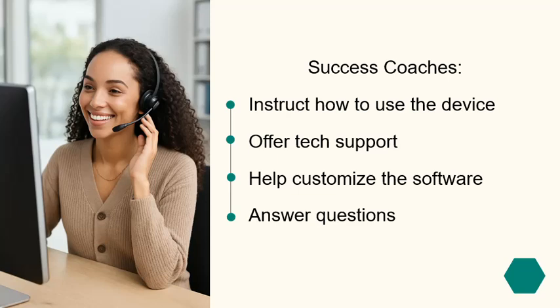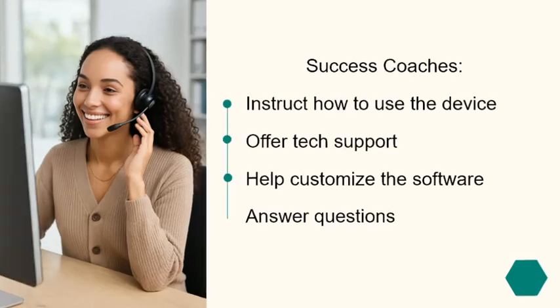You can rest assured that you have EyeTech support for the life of the device. We want nothing more than for you and your loved one to succeed on this communication journey.